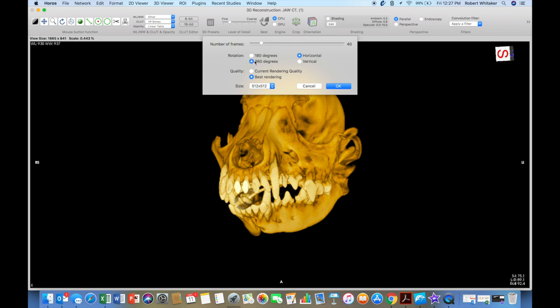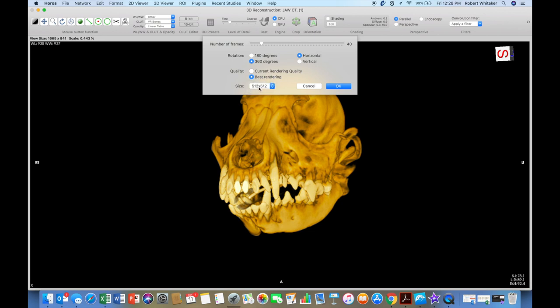And then I do 360 degrees on my rotation. And I want the rotation to be horizontal across the screen, not vertical up the screen. My current rendering quality is great, but I want to get the best. And then my size, I'm going to choose 512 by 512, because that usually fits Instagram and Facebook, Twitter all really well. Press OK.